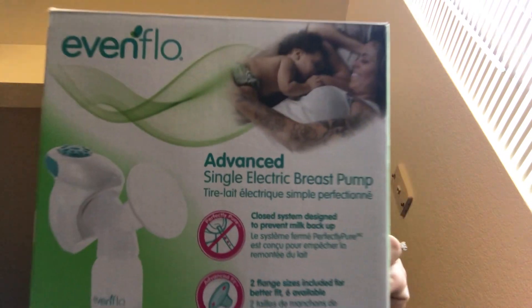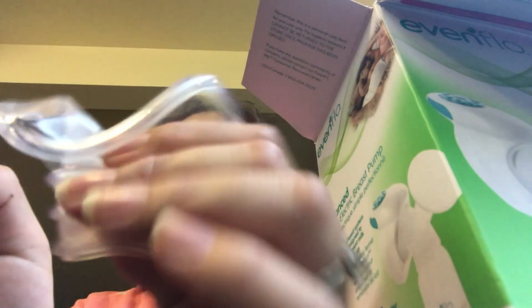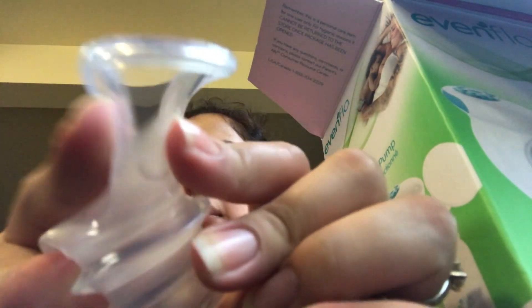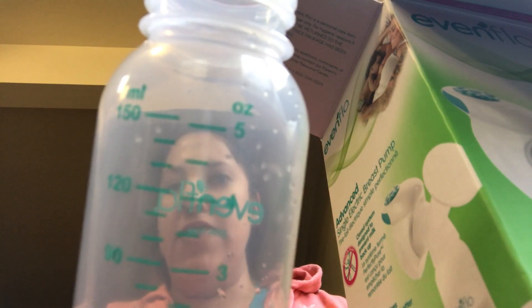The box looks like this. And it comes with this attachment, kind of a flange, and it's very soft, as you can see. It comes with one of these kind of cups. It measures up to 5 ounces. It's a little bit wet because I just washed mine — I've been using it.